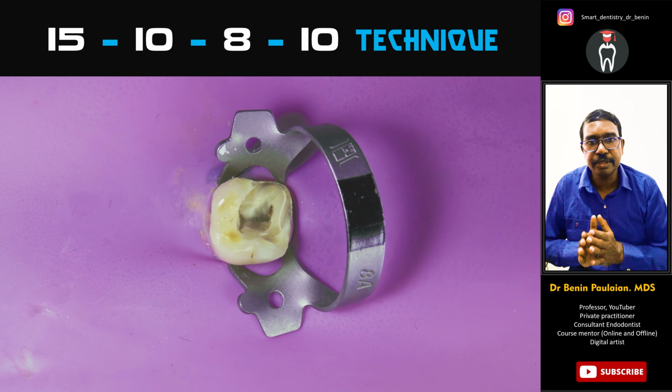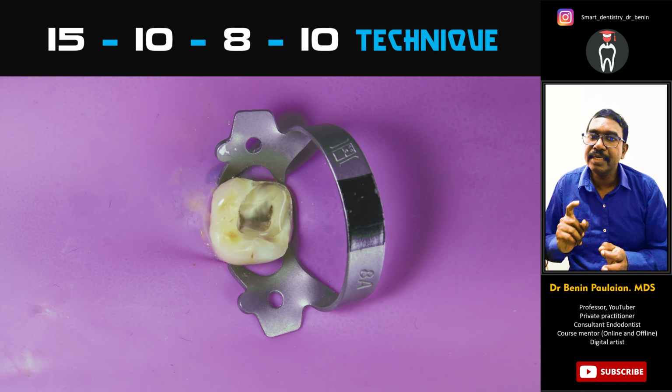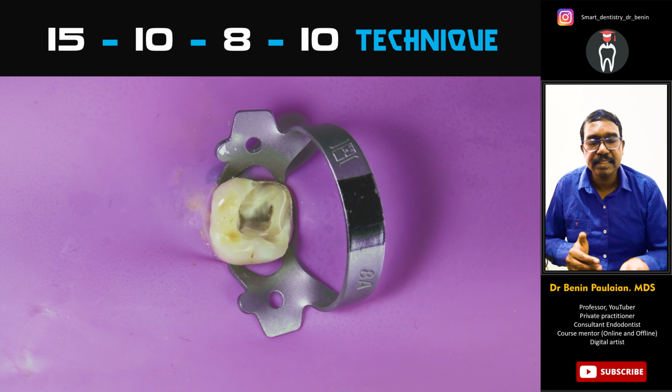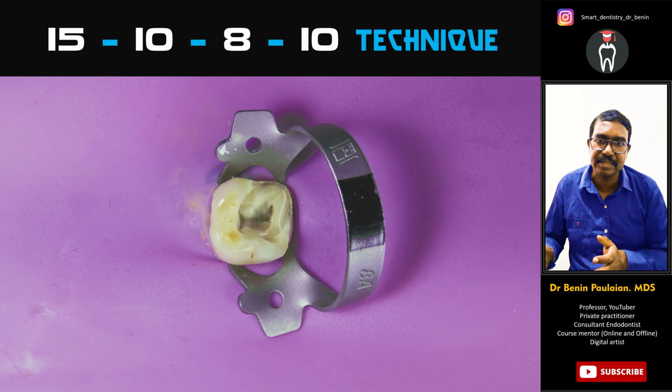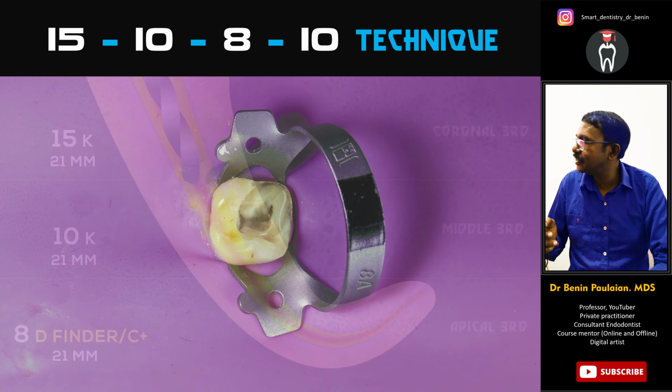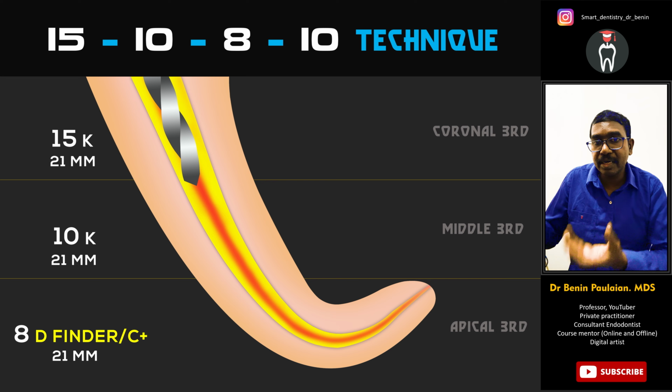While doing canal negotiations, the pulp chamber should be always filled with sodium hypochlorite and not EDTA. EDTA will cause more of procedural errors and it will not help you for canal negotiation. So never use EDTA at this stage. At this stage, simply use sodium hypochlorite. Once that is done, now you remember that.